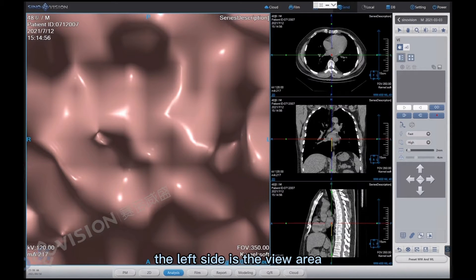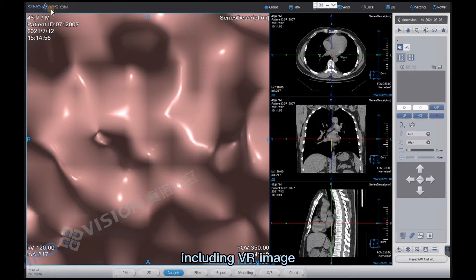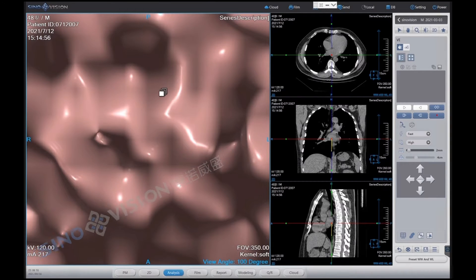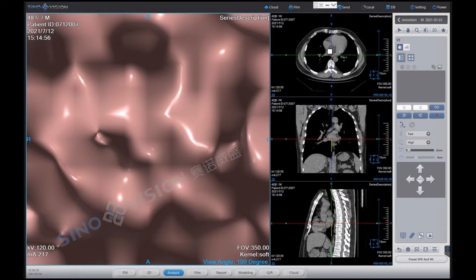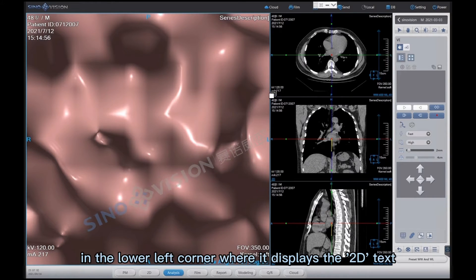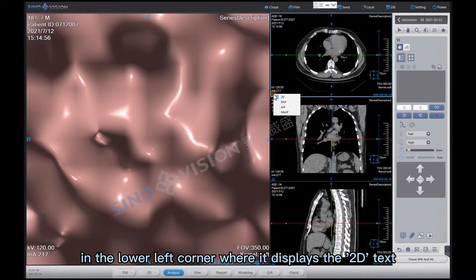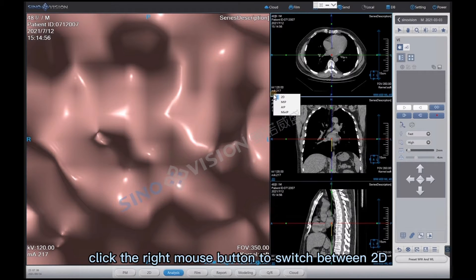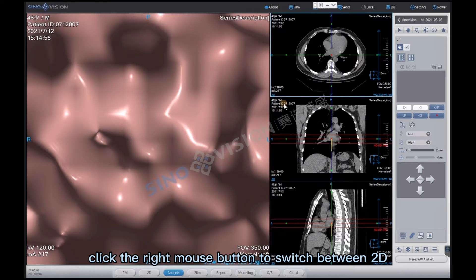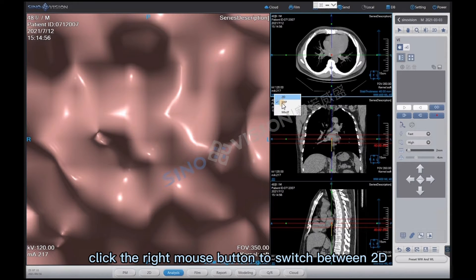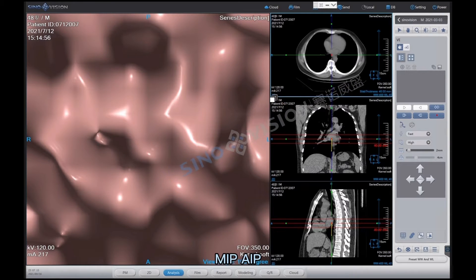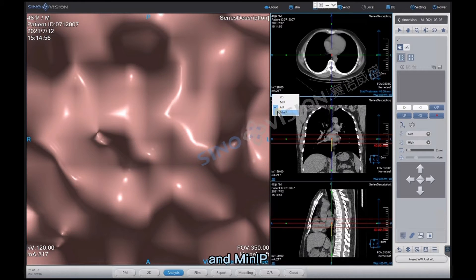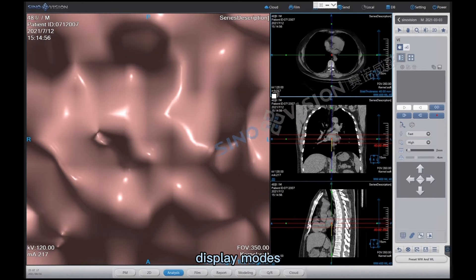In the VE interface area, including VE image display modes, AIP and MiniIP display modes.